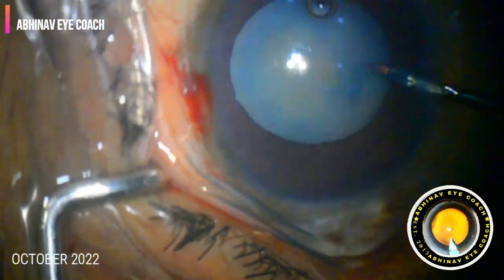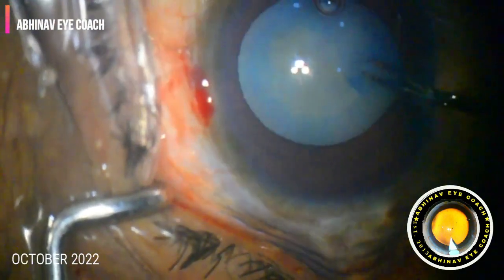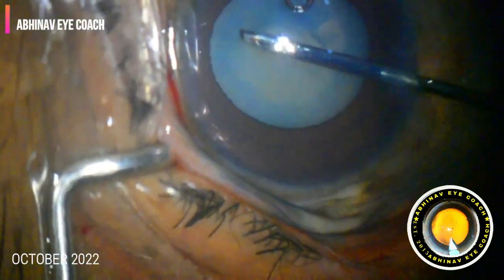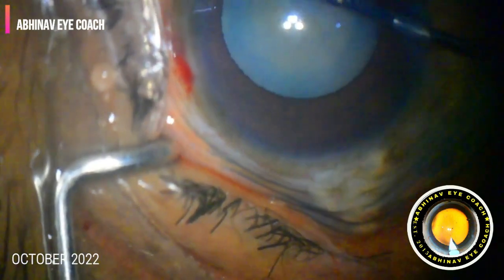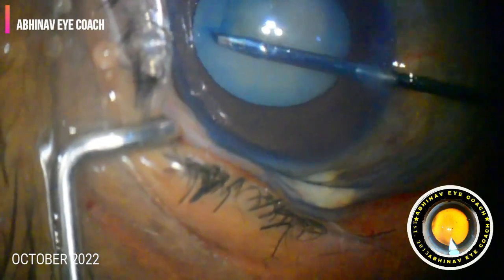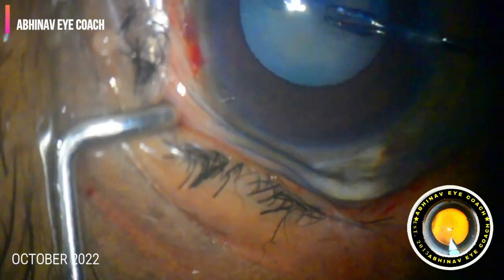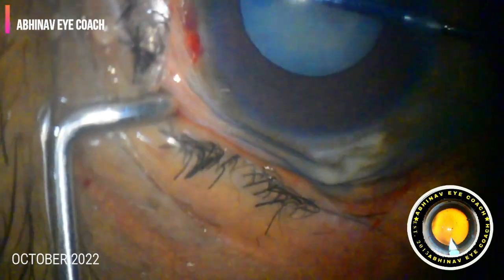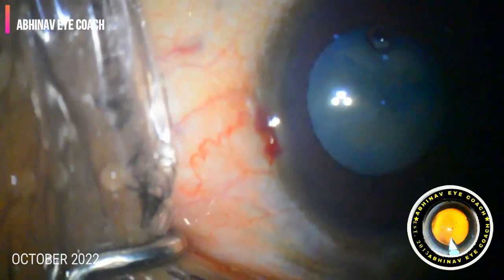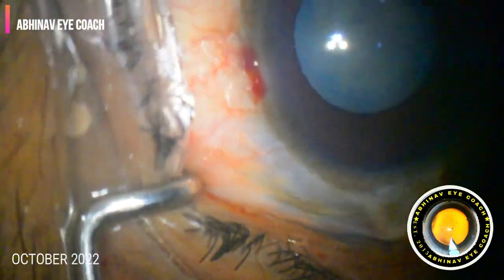We started making the bigger rhexis. With this technique there are very few chances of the rhexis extending into the periphery, because of the lowered intralenticular pressure and fewer chances of getting the Argentinian flag sign. Here we finished with an adequately sized, very strong, circular rhexis.